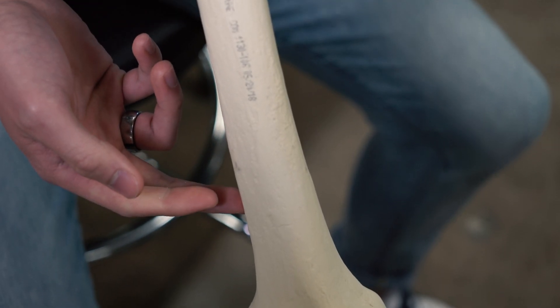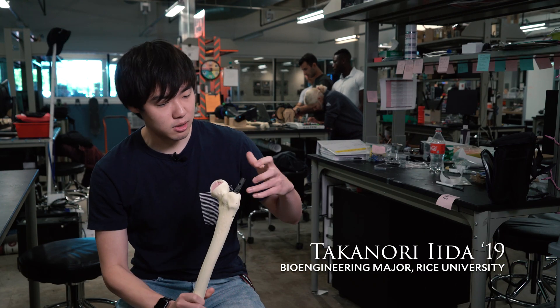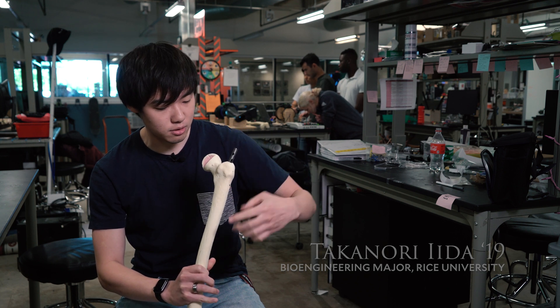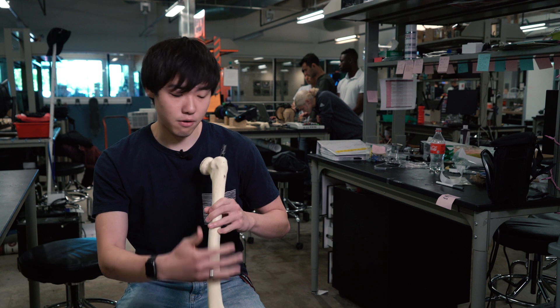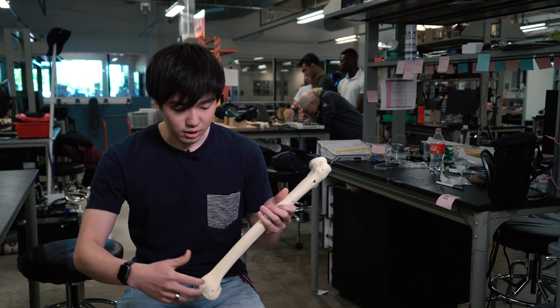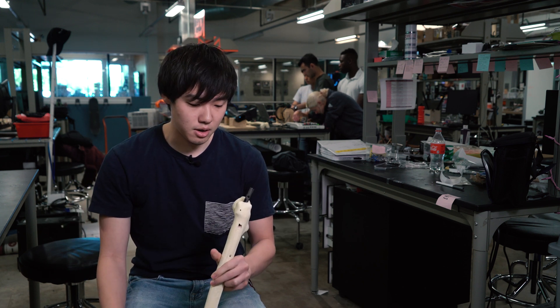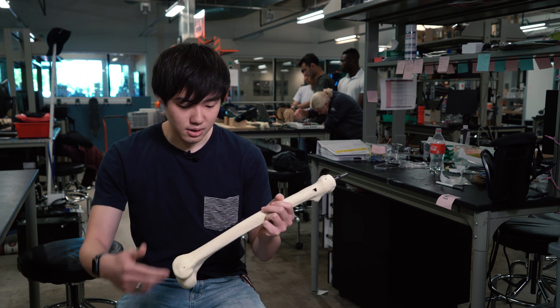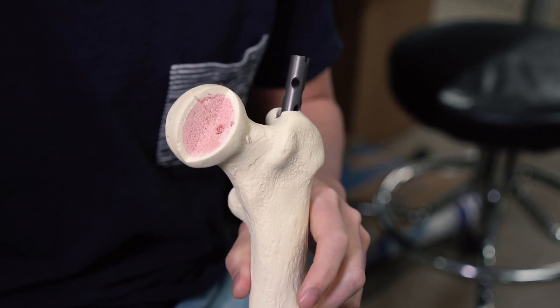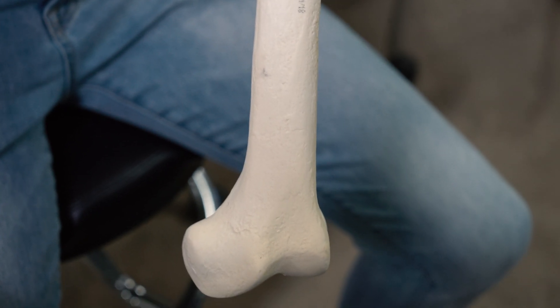For the top screws, since they're close to the top, there's an alignment device that attaches and aligns perfectly. But for the bottom screw holes, which are farther from the top, a surgeon manually aligns using x-rays. This is a big problem because x-rays are two-dimensional and we're working with a three-dimensional problem — it can take up to 45 minutes just to align these two screw holes.